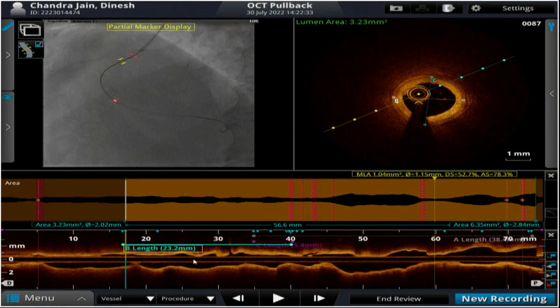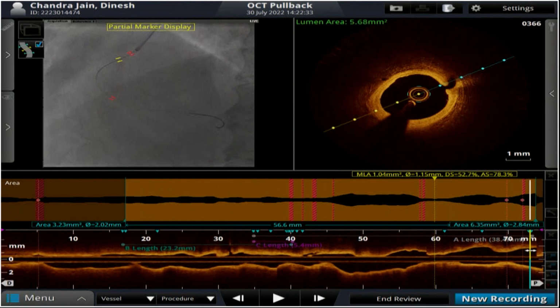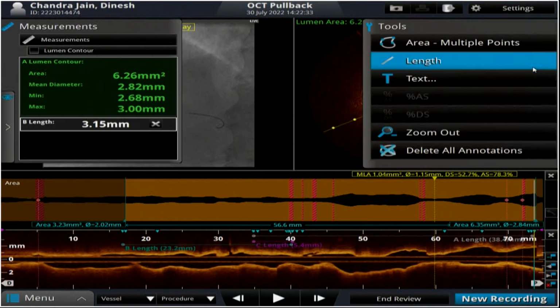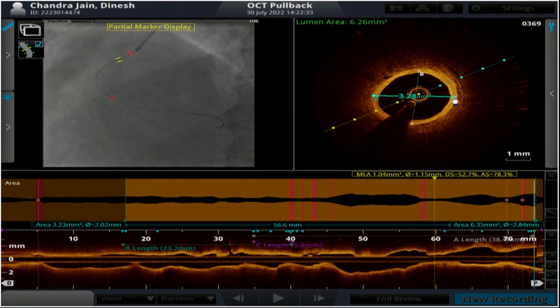Similarly, we come to the proximal landing zone. Come all the way back to the proximal landing zone. Now, this is a proximal landing zone where again we see a trilaminar. Yeah, very nice approach, 3.1 and 3.2 to get perfect information.